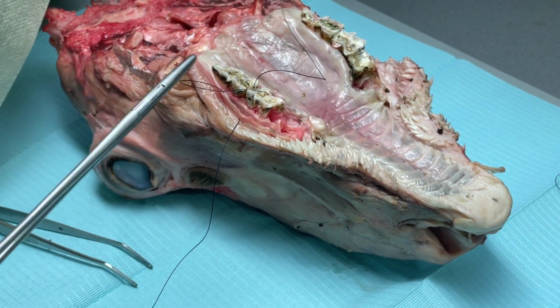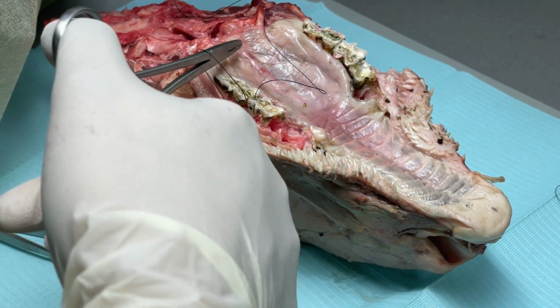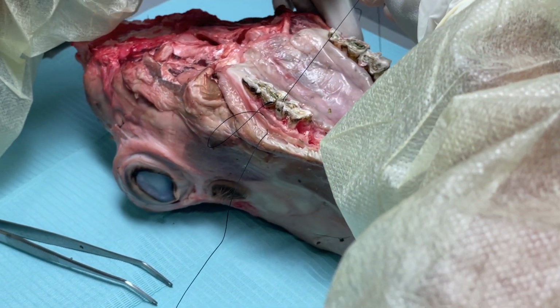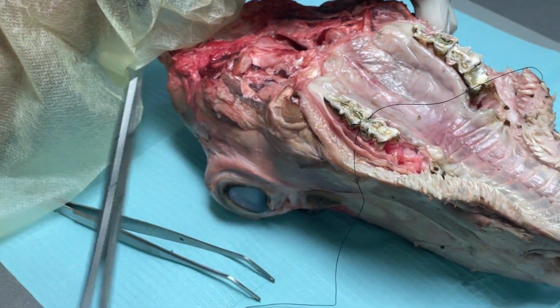Now same thing, when you're doing this in the patient's mouth also, sometimes when you're pulling, this loop will get onto another tooth and lock there. Just be relaxed, keep it normal, then pull it.